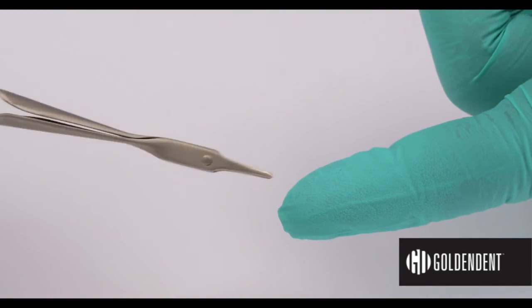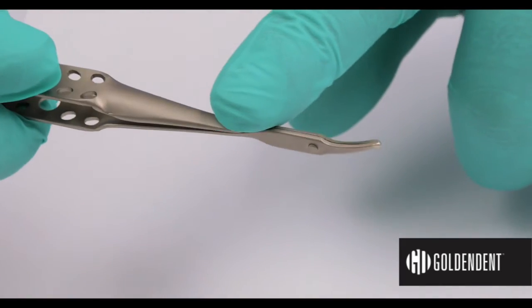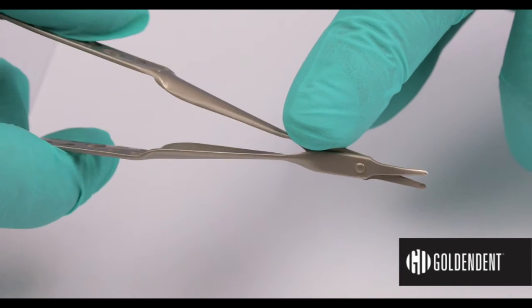In these types of situations, since the scissors are designed to remain open, it can actually gently push the tissue aside and only cut the suture, again leaving the tissue unaffected.